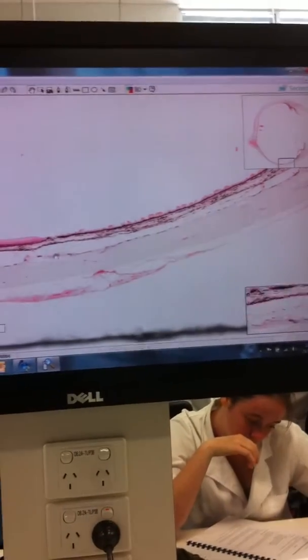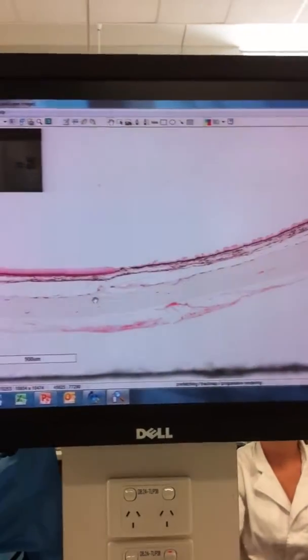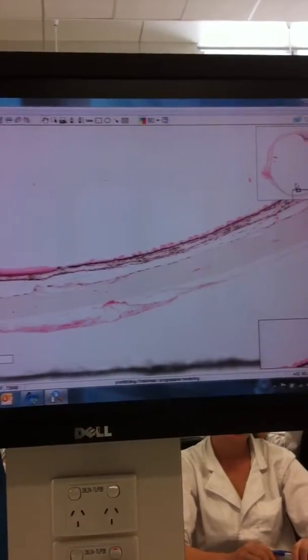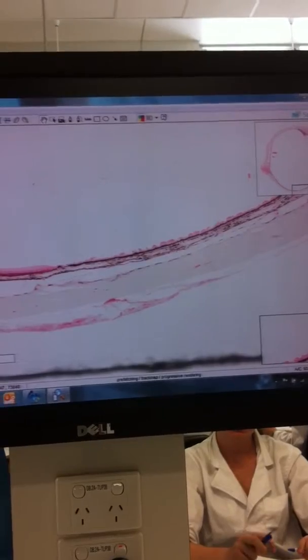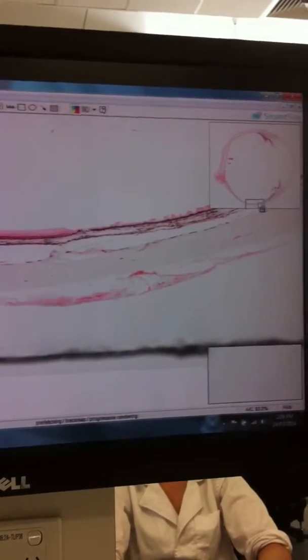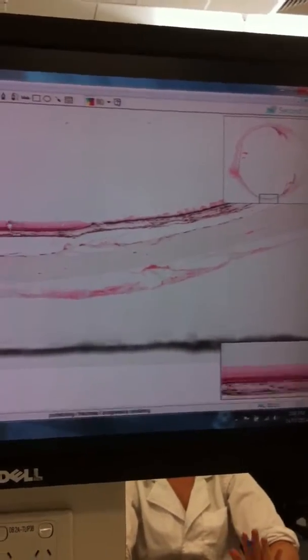Now, if you look carefully here, we've got a couple of structures that we'll look at in greater power elsewhere, but we'll just look at here generally. I'm in an area a little bit behind the iris, the ciliary body, just about here. There's a structure here which is the retina, and it seems to stop. All we've got left is wispy bits and some pigment. That really is the ora serrata, the junction between visible, or seeing, retina and non-seeing retina. So if you imagine light coming through the eye, it wouldn't come down here, it would come down here and hit the main retina.